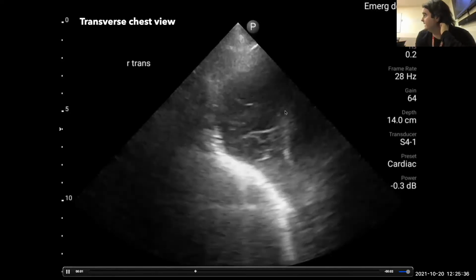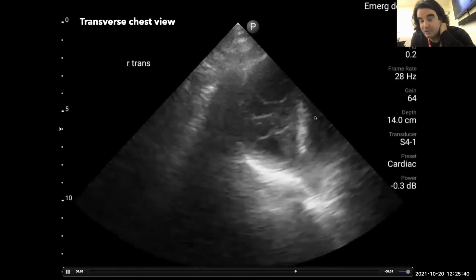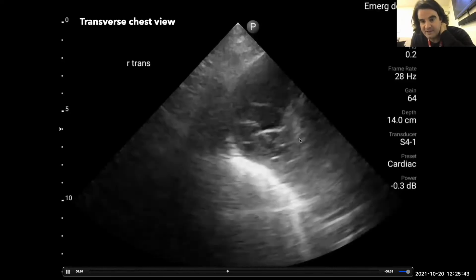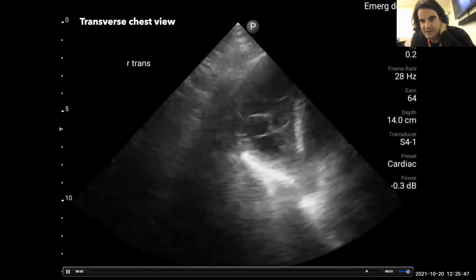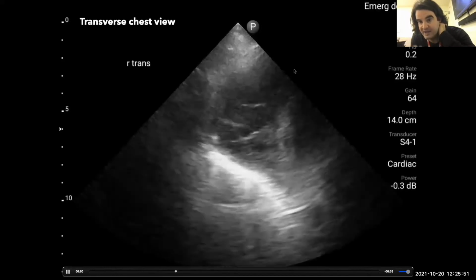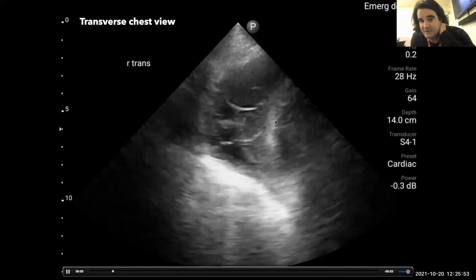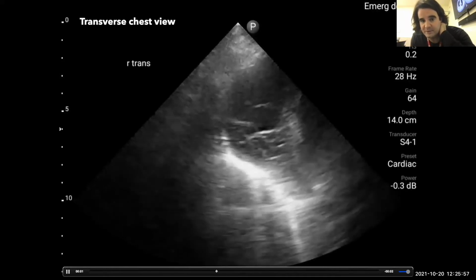You also have to be leery of what you're looking at here, because you can easily be below the diaphragm, albeit this looks like it's probably liver centrally here, then the diaphragm, and then chest wall. I moved up and down the chest wall to make sure I was in fact above the diaphragm, and this finding was fairly consistent. This is a fairly generously sized complex septated pleural effusion.